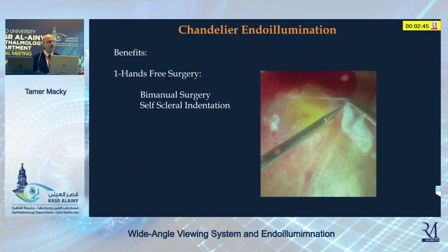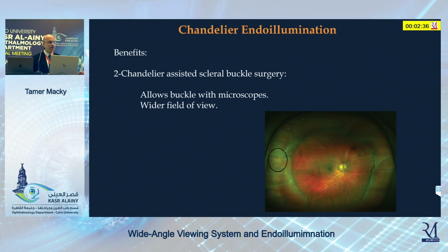The benefit of the chandelier is you have a free hand. You can use it for bimanual surgery and scleral indentation, and we can also use it during chandelier-assisted scleral buckle surgery, which allows the surgeon to sit at the microscope and have a wider view.